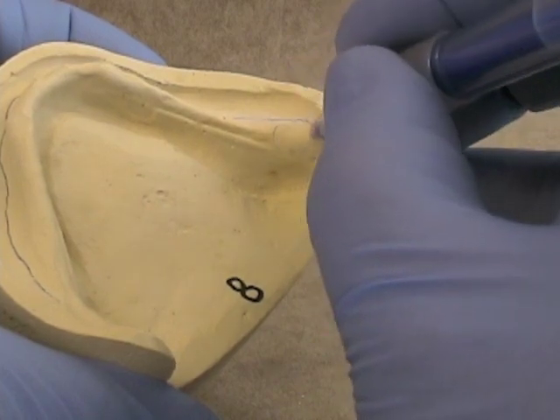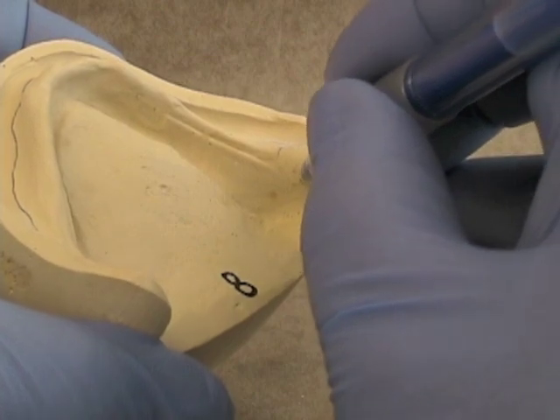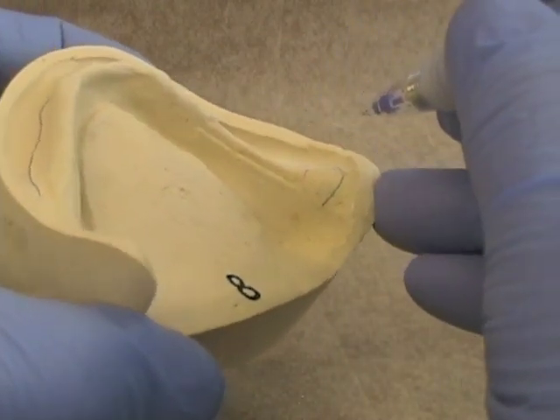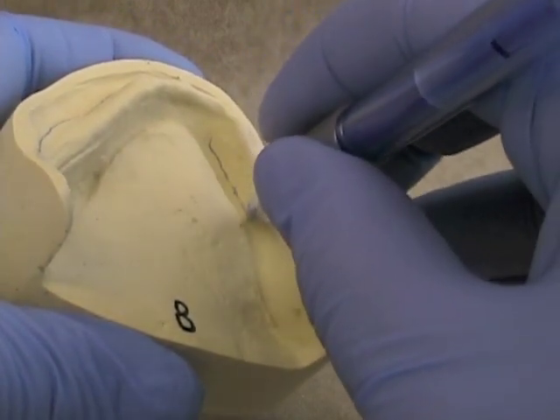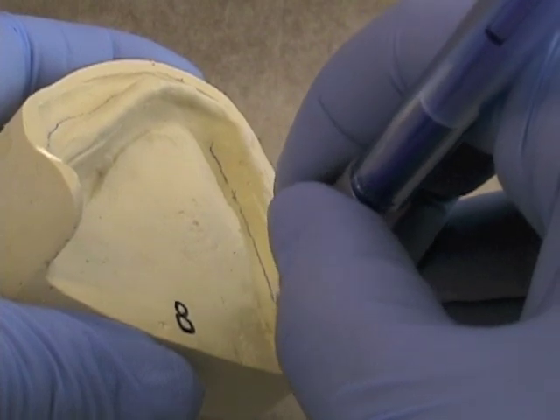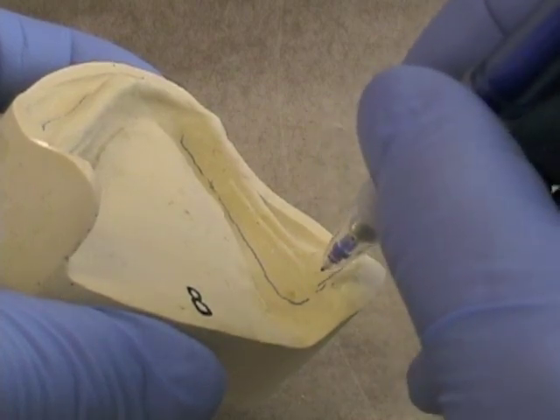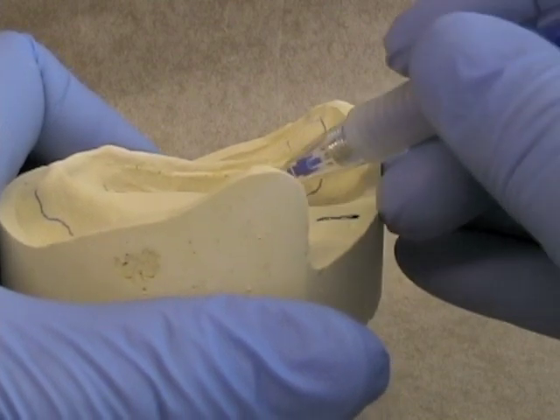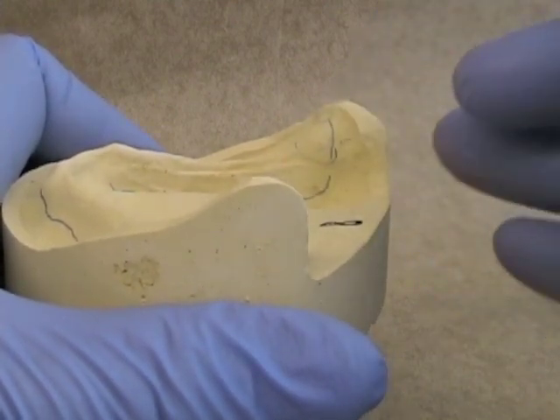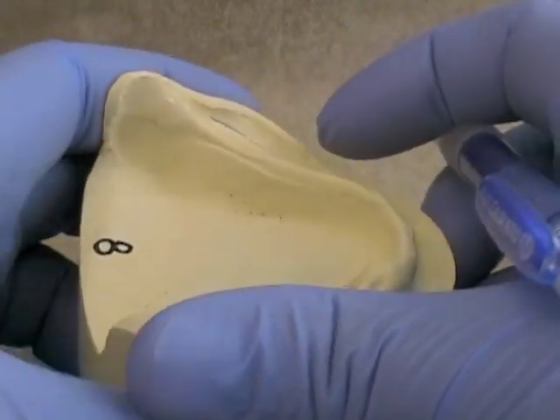Here's our retromolar pad in this area here. We need to make sure that we've at least caught part of that retromolar pad, and we need to make sure that, again, we're a little bit shy of the lingual vestibule. Remember that the tray should not come back from the retromolar pad. It should either come straight down and forward or should angle slightly forward. It will depend on the shape of the lateral throat form for your particular patient.